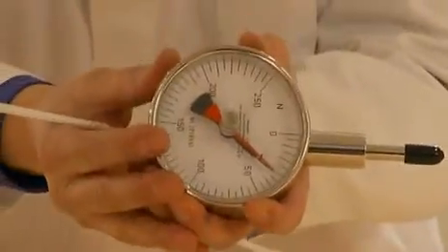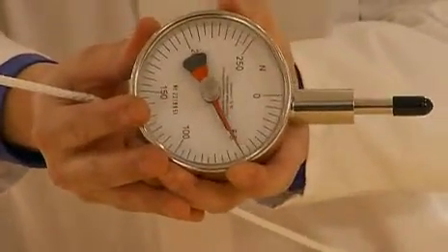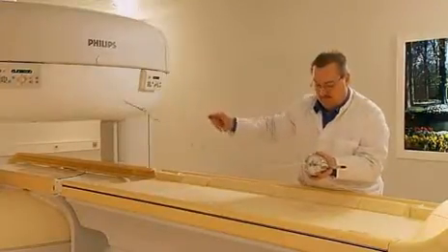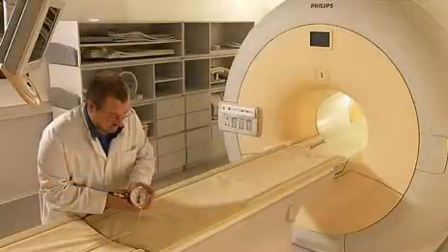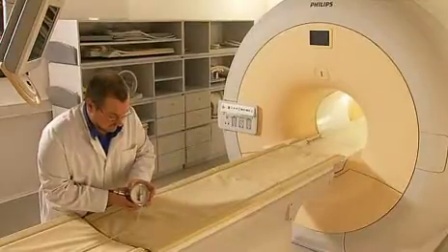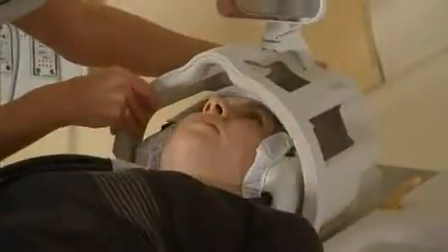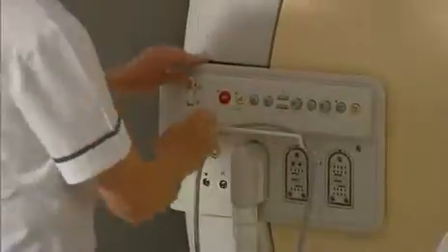These forces are generally higher in the case of open systems, even when the magnetic field is lower than that of a cylindrical system, due to the different design of the magnet. Scanning a patient at field strengths above 2 Tesla represents a proportionately higher risk, requiring additional attention to the patient.